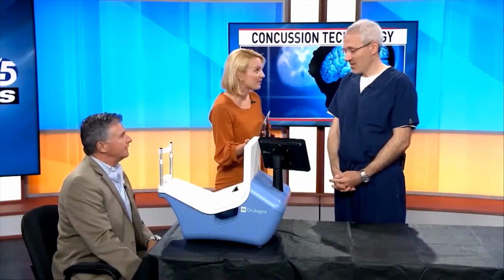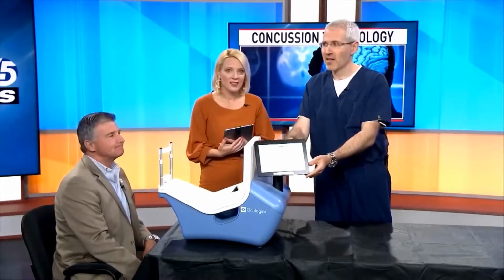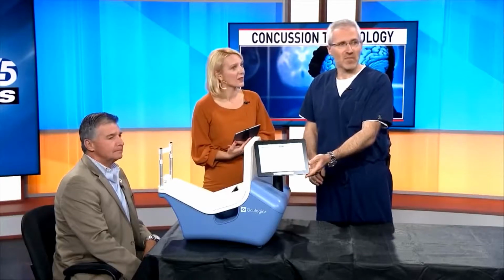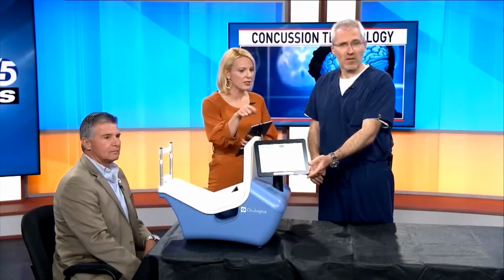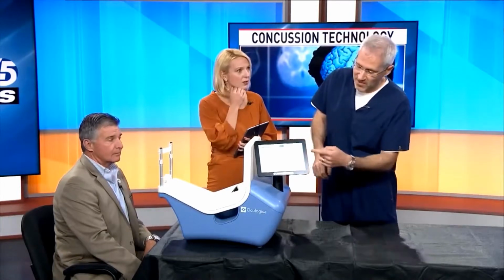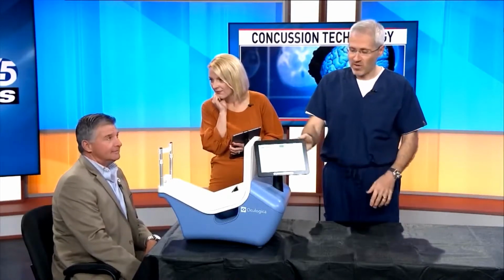The results are in. I'm going to show everybody what I'm looking at over here. It comes up on that screen right there. It might be hard for them to zoom in on, but you can see exactly his results. He did pretty well. Mr. Bateman, you've suffered a couple of concussions in the past, correct? Yes, sir, I have. So his number's a little bit high.